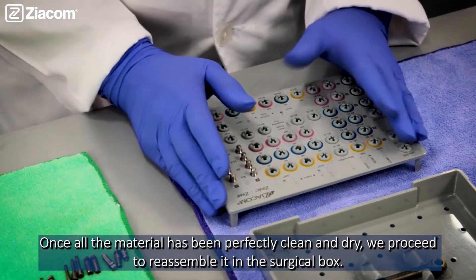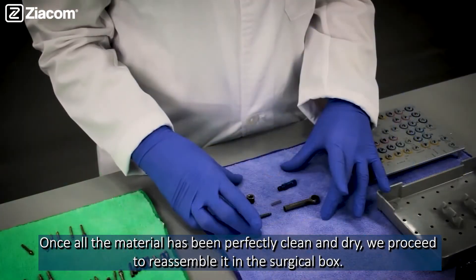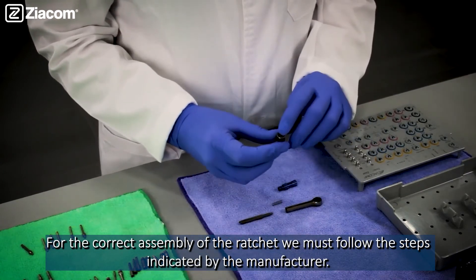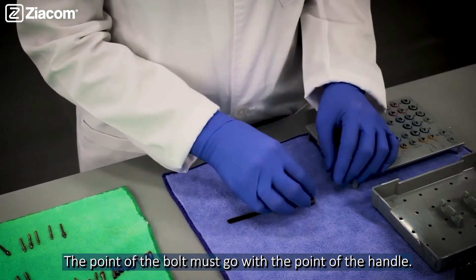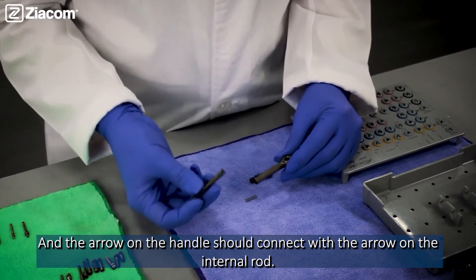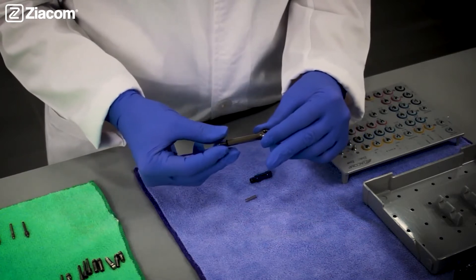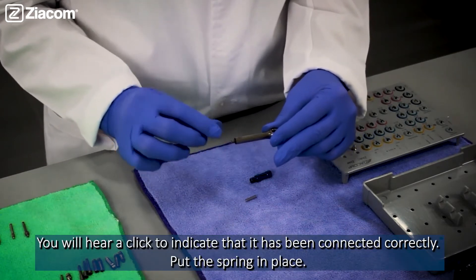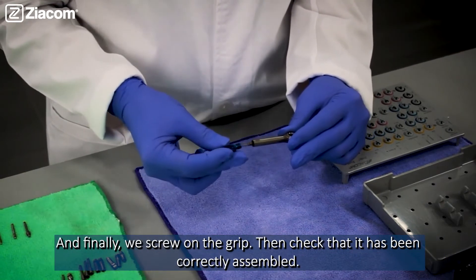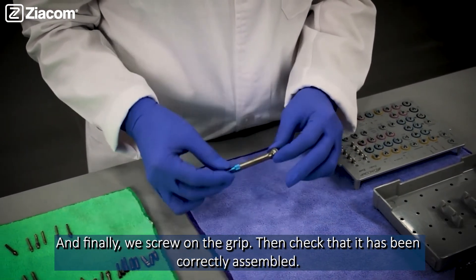Once all the material has been perfectly cleaned and dried, we proceed to reassemble it in the surgical box. For the correct assembly of the ratchets, we must follow the steps indicated by the manufacturer. The point of the bolt must go with the point of the handle, and the arrow on the handle should connect with the arrow on the internal rod. You will hear a click to indicate that it has been connected correctly. Put the spring in place, and finally, screw on the grid. Then check it has been correctly assembled.